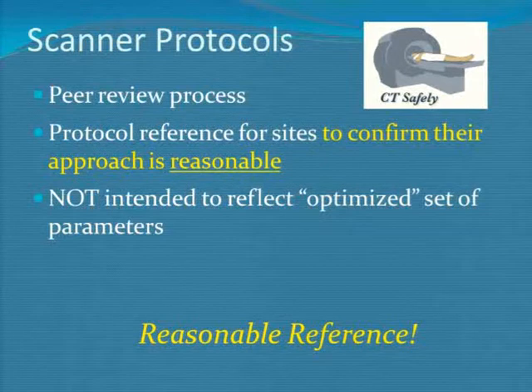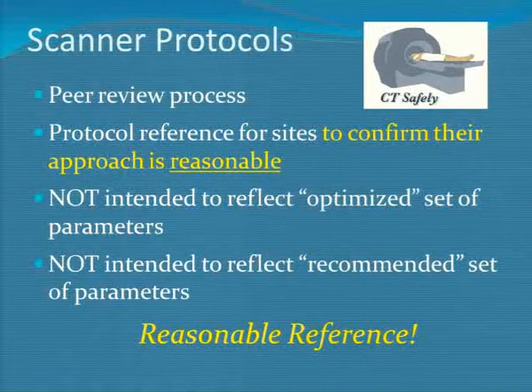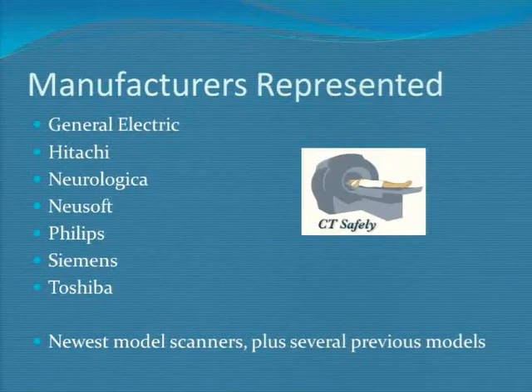It's not optimized in any sense. It's not perfect, and it's not even necessarily recommended. It's just a reasonable set of protocols for each basic exam. We've got 7 manufacturers now represented, including a few of the smaller ones. So if you're not aware of that, you might want to check that out if you have some of these other scanner types.